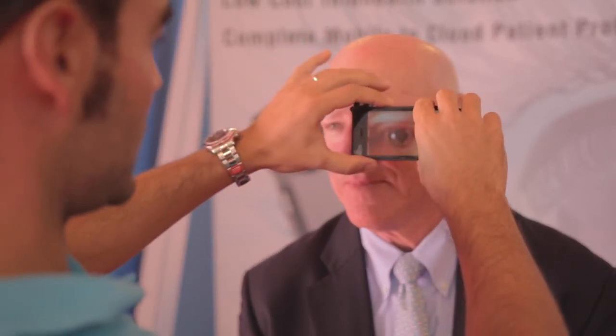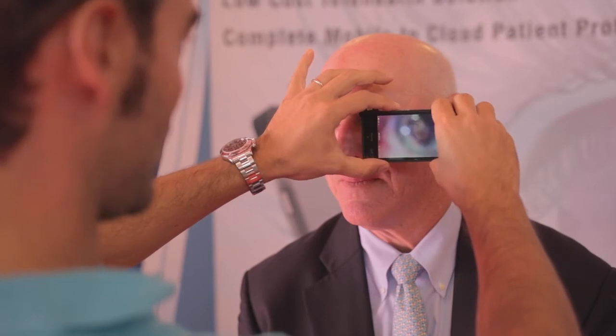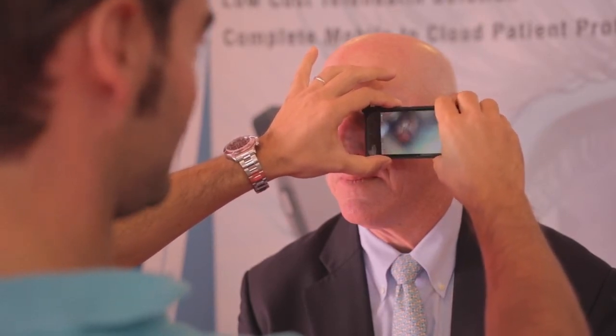It's really easy and straightforward to see the optic disc nerve. It's just one, two, three. You just go near to the eye and you can find the optic nerve head, the vessels, the macula, the fovea.